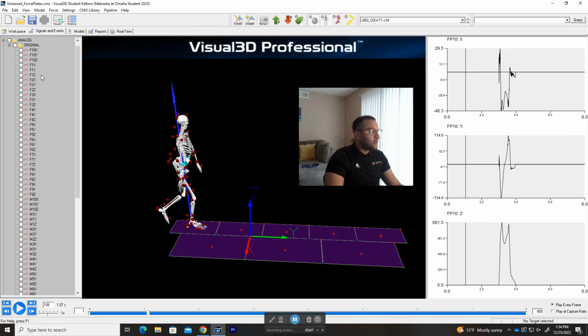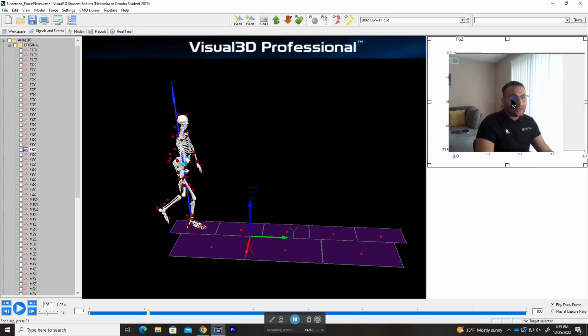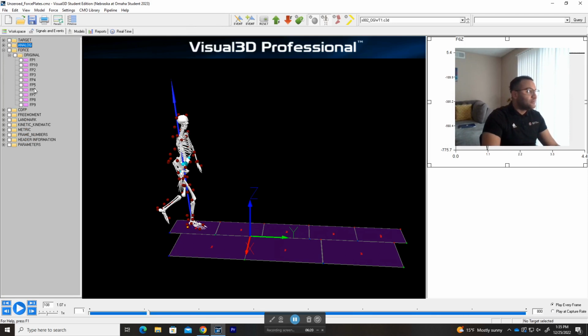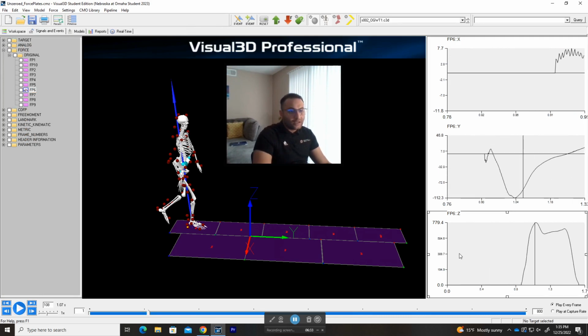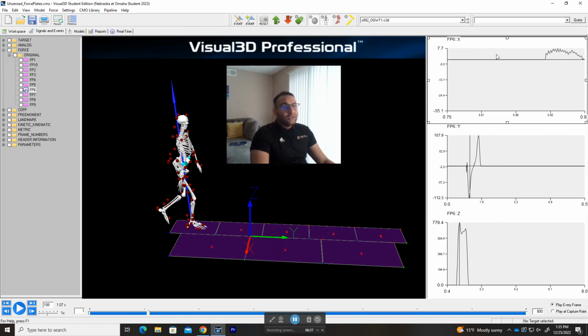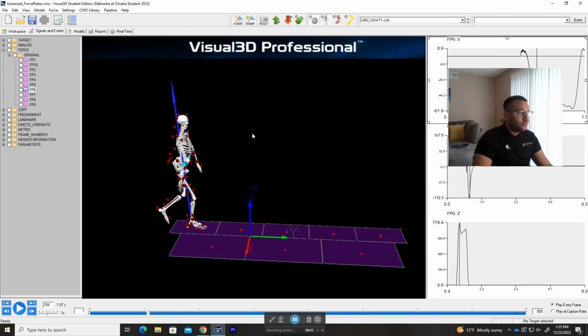If you check it in the analog section as well, I believe that it does fix the FPs, all of the FPs. I'm sure that it does that, but let's check here. So it actually does not fix the analog, but it does fix the FP. So when you face a problem like this, you'll only fix it in here. You see it's fixed, but it does not fix it on the analog. So make sure, if you do face that problem, you use only the force plate data from the force type folder.